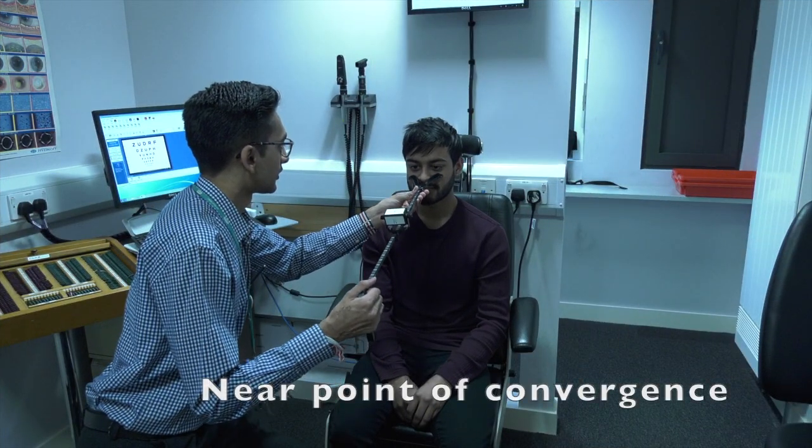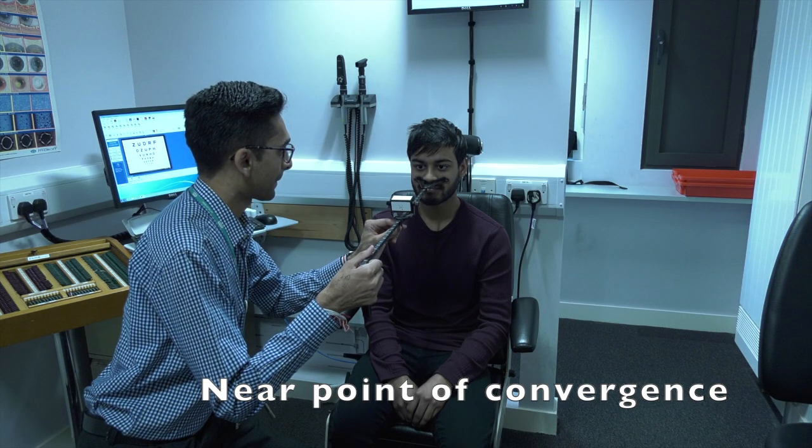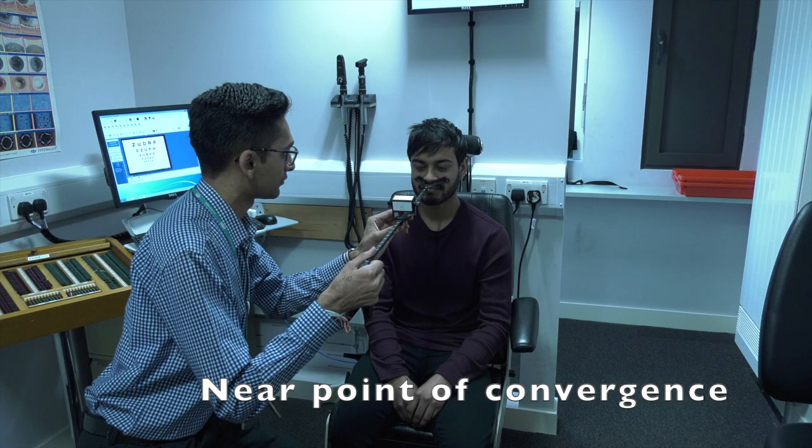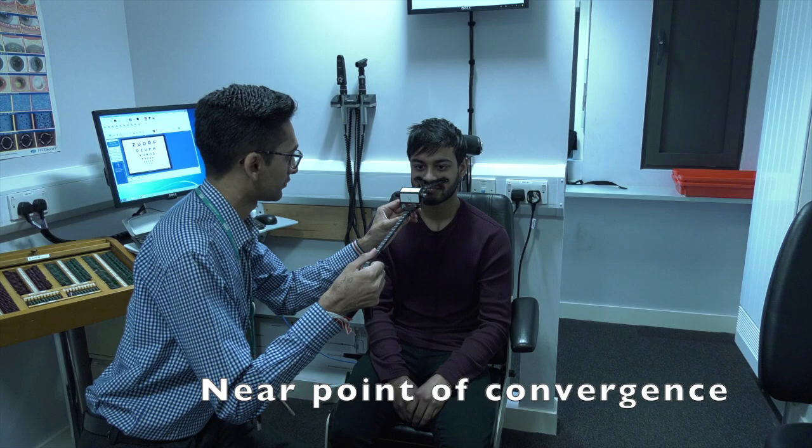For near point of convergence, a specially designed ruler will be placed on your cheeks whilst you are asked to focus on a small target. This target will be gradually brought closer to your nose.